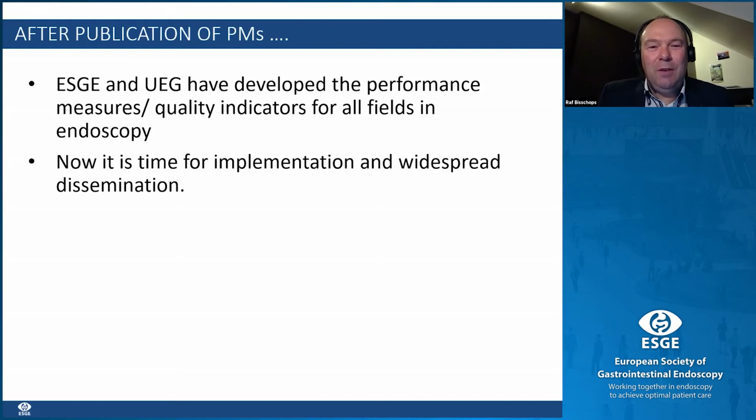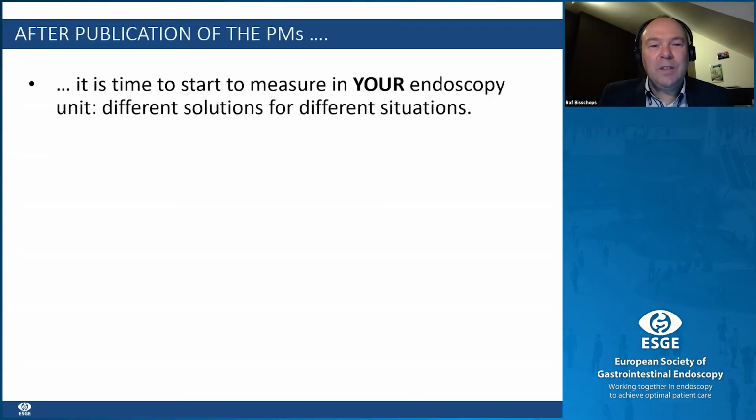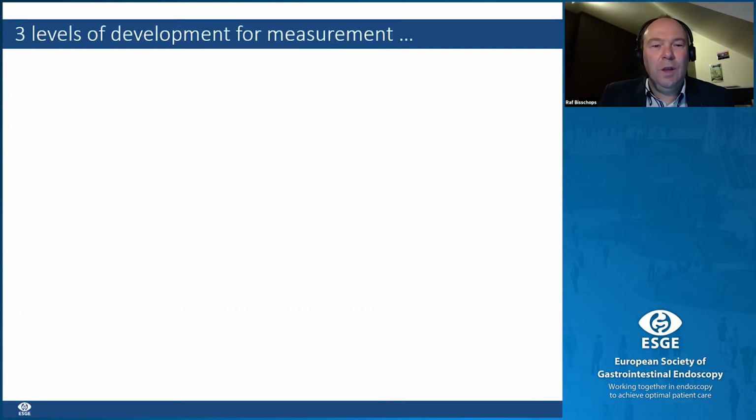Over the past 5 years, ESGE has developed different quality indicators for all fields in endoscopy, and now it's time to implement and disseminate them. And it's really time for you to start measuring the quality of your endoscopy unit. And there are different solutions depending on where you are.